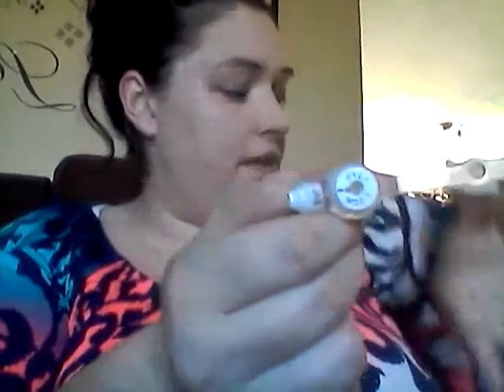So you'll see that. Oh, he did find it. Thank you, Aiden. Okay, so here is the Mickey button. Here is the tube. And you see where the line is that I was trying to tell you. Okay, so pretend my hand is Evan's tube site. So we're going to place this and see how the lines are lined up. Then you're going to press in, and you're going to turn until this line on the tube is facing in the opposite direction as it was whenever you put it into the Mickey button. So see, now I'm pulling pretty hard, and it's not going to come out.